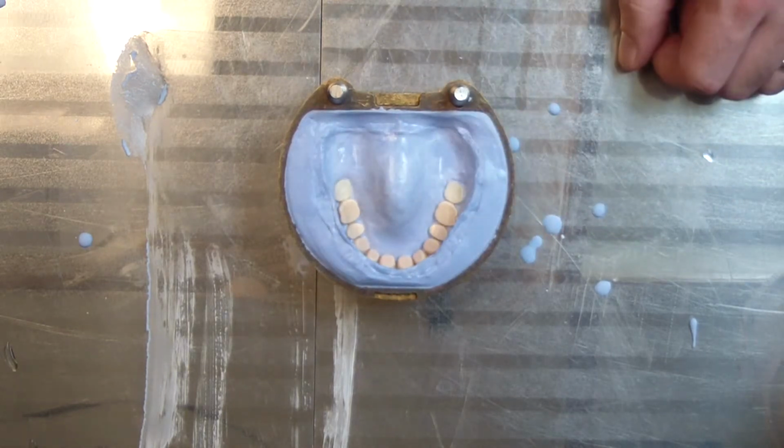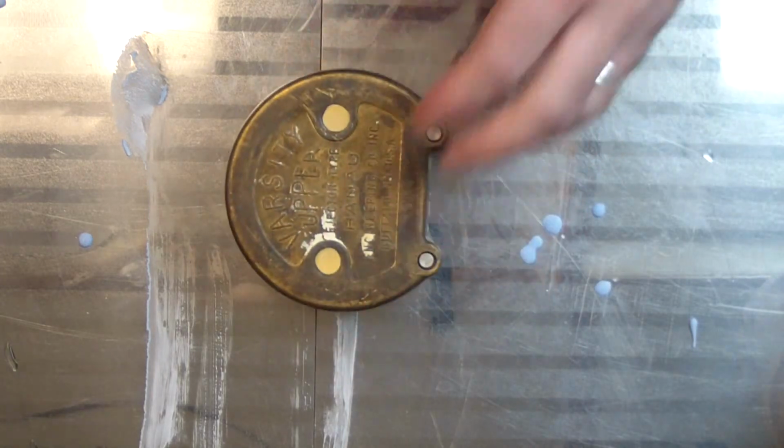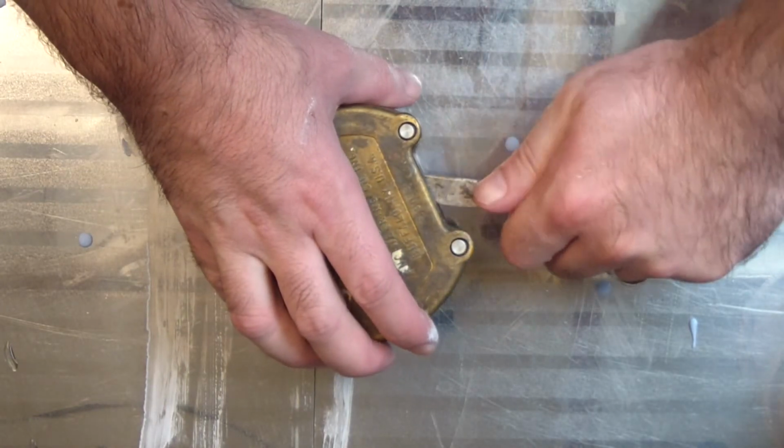After this you obviously will pack your acrylic and process it, and so the final step I want to show you, I just had one cure and it actually just finished cooling, so I'm going to show you the deflasking, just to show you how well the stone separates from the finished prosthesis, so you don't have any issues later on.